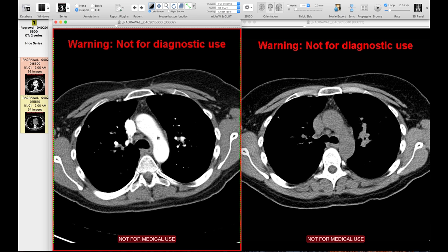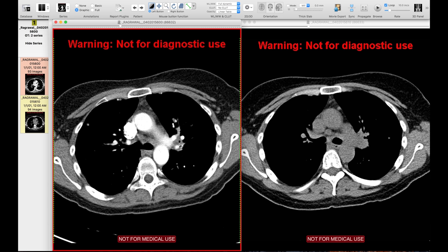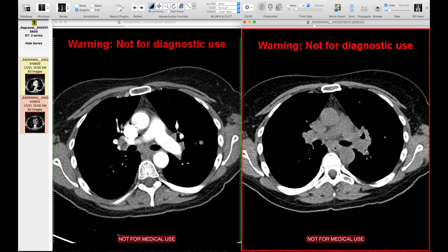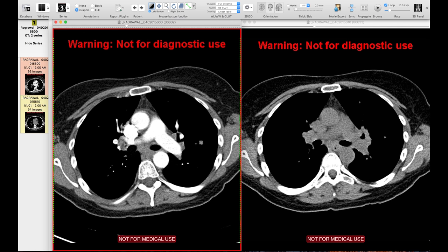I have two CTs here of the same patient — a patient with sarcoid — to illustrate the difference between getting a study with contrast versus non-contrast. Looking at the mediastinum, there's a lymph node that's pretty well seen on the contrast-enhanced study, and actually pretty well seen on the non-contrast study too. The key difference is in the hila: you can see soft tissue in the left and right hilum on contrast, but on the non-contrast study it all looks like one contiguous blob — you can't see the definition between the lymph nodes and the vessels.